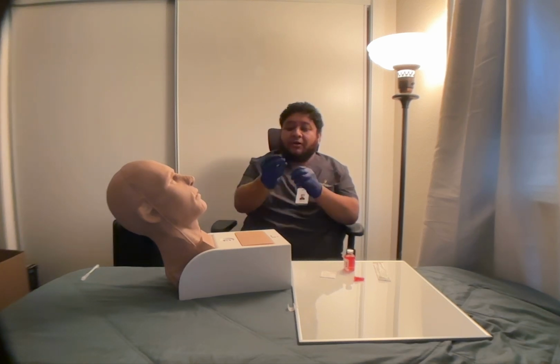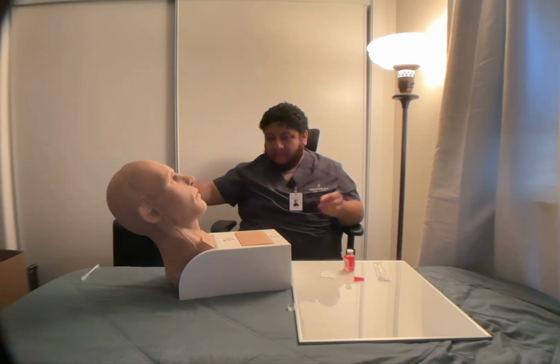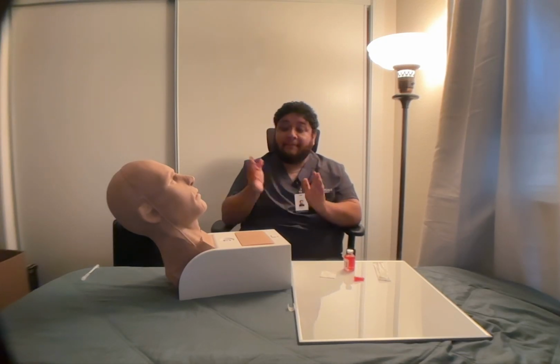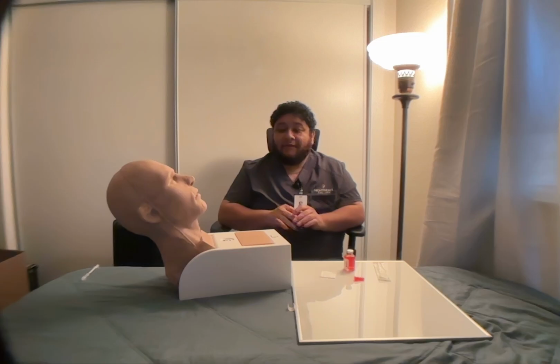Okay, I'm gonna go ahead and remove my gloves. Discard. Perform hand hygiene. Okay, now I'm going to make sure my patient is comfortable. If they have any other questions, provide the call light, gather my remaining supplies, exit the patient's room, and I'm going to go ahead and document everything that happened today.